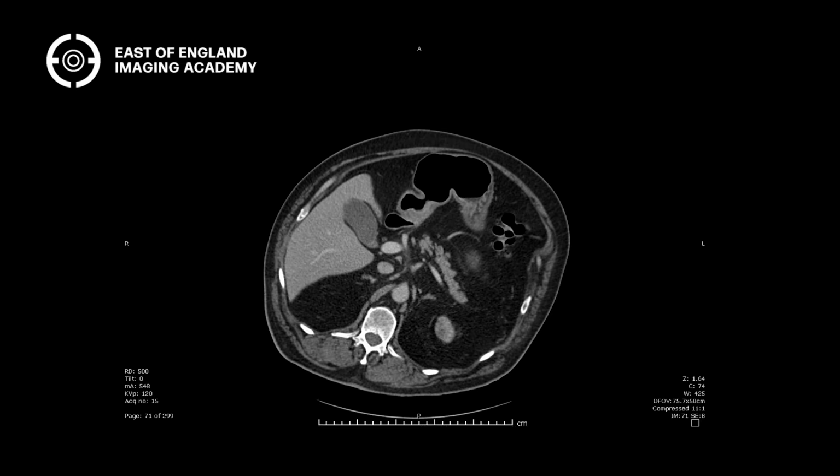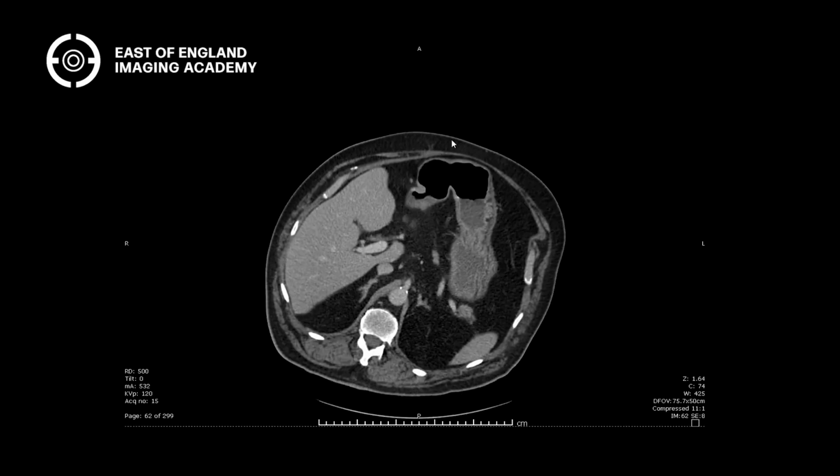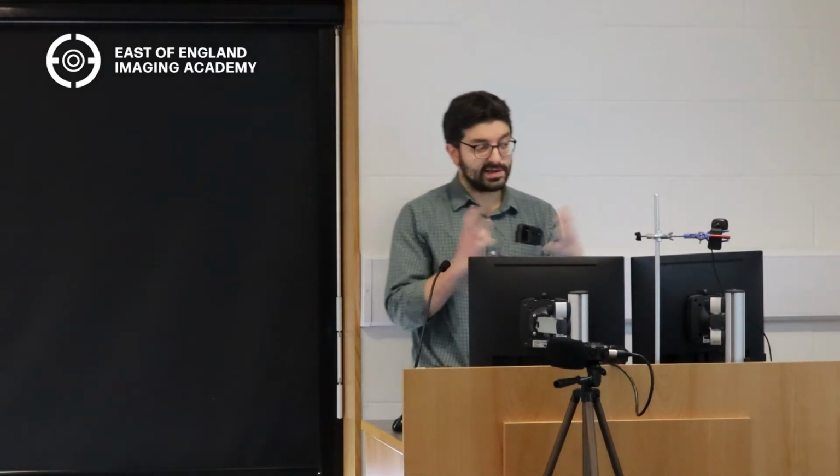When you're looking at a CT scan, what you've got to remember is that CT is effectively just like a plain film, but as if you've taken X-rays from 360 degrees around the patient. You plug the data from those X-rays into a computer, and the computer puts back an image. Because you've taken images from around the patient, it acts a bit like a simultaneous equation, and the computer puts it all together and can create a 3D image of what's inside the patient.